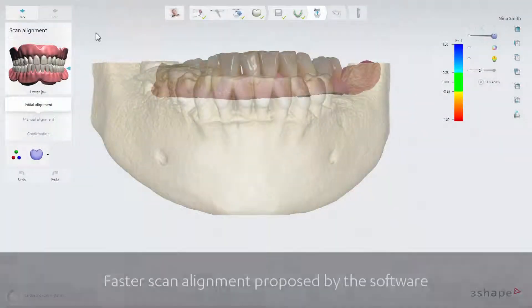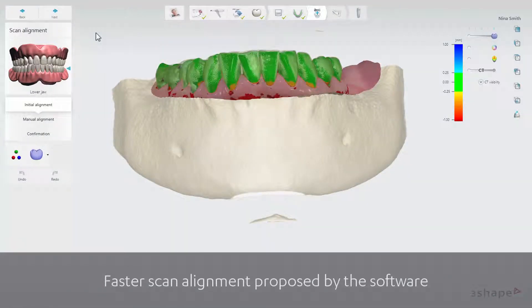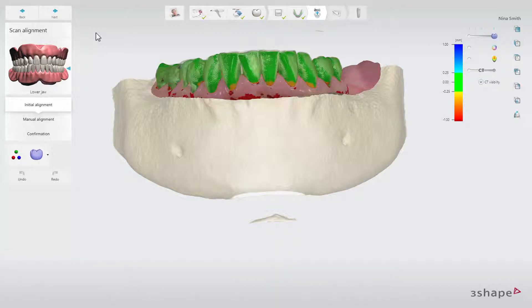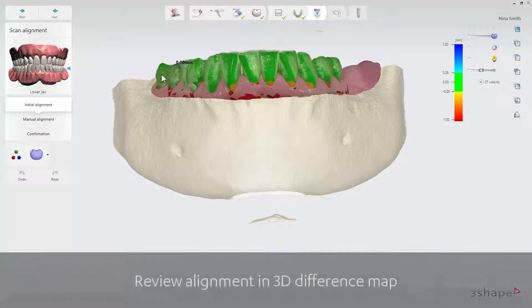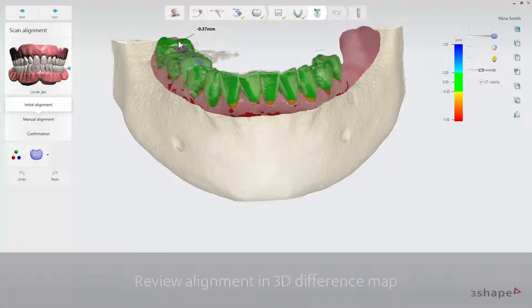The CT or CBCT scan and the surface scans are now initially aligned by the software. That means the user only has to review the alignment and, if satisfied, click Next. You can review the scan alignment by checking the difference map, which is now displayed in 3D by default for your convenience.